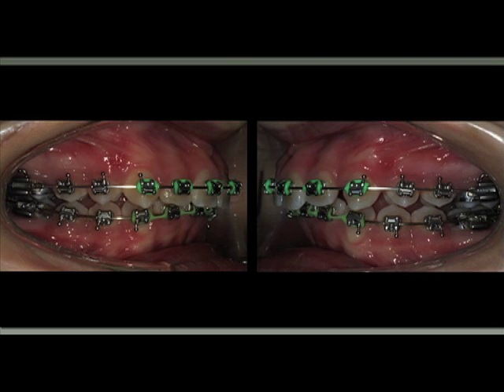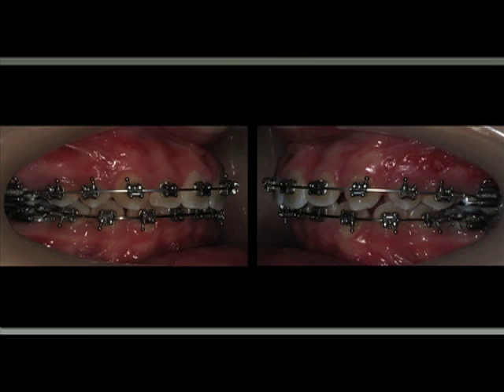And here I have the upper arch level and the lower arch with a reverse curve of Spee. I put the reverse curve of Spee with my hands in the lower arch wire stainless steel, and at the same time I asked the patient to wear a class 2 elastic, short class 2, upper canine, lower second premolar. And you can see that as we do this, the curve of Spee in the lower arch gets flat. And this is how we parallel the occlusal plane, as you can see over here.